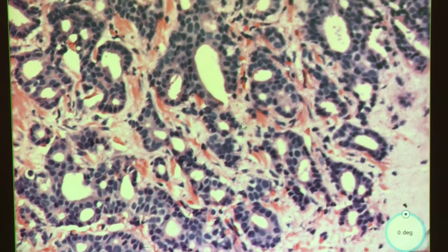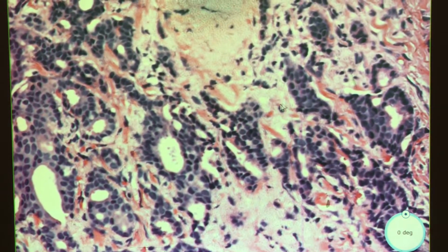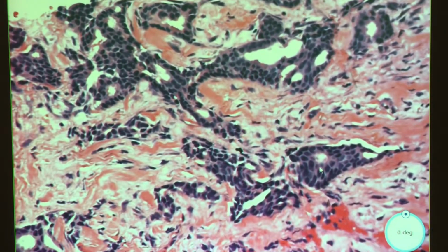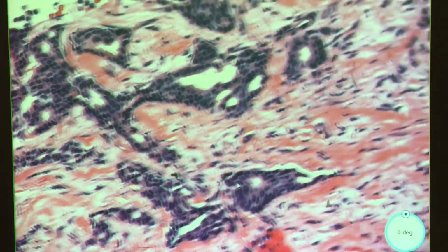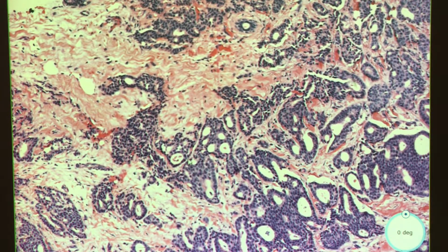Then when I go to the actual cells themselves, they're fairly regular. Like there's maybe a few cells that are a little bigger than others. But as I say quite frequently, are they potatoes, are they gourds? So to me, these are potatoes. They're trying to look alike, which in breast is always scary, right? Okay, but it pretty much doesn't matter where you go on these slides. You're going to see the same thing.